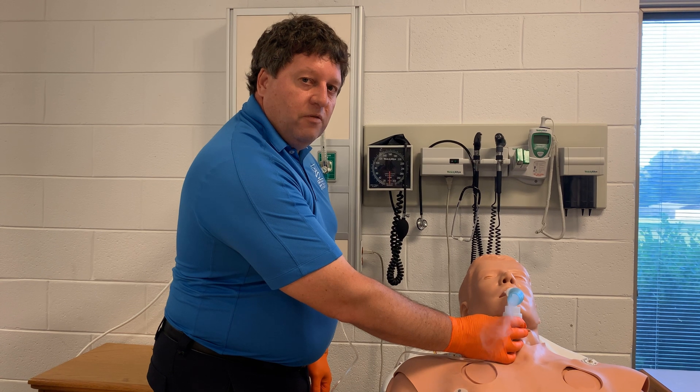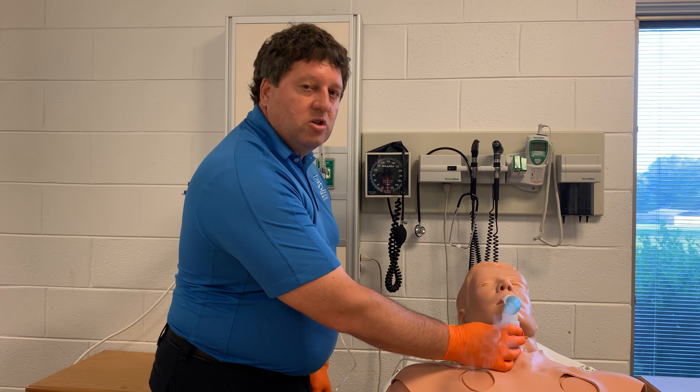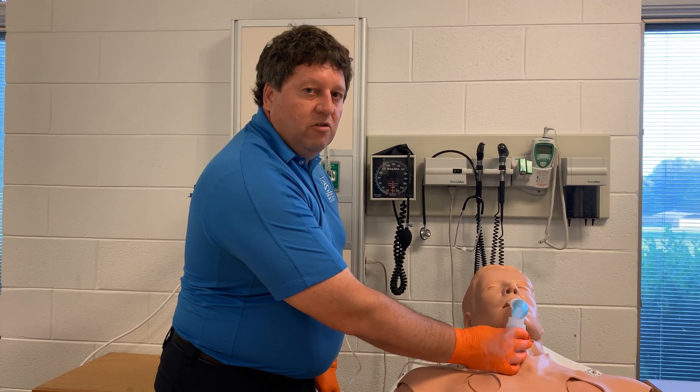Advise your patient that they're going to feel a little anxious and jittery after this, and then you want to reassess your vital signs. Make sure you listen to your lungs, monitor your pulse ox, and put them back on oxygen as needed.